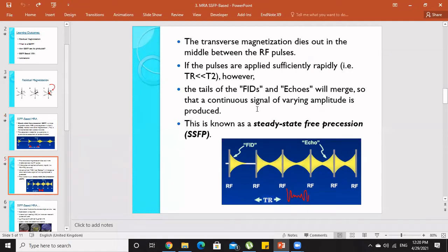Why? If you are giving it equivalent to the T2 or far beyond that, then there will be another phenomenon. If you are achieving the T2 weighted image, it will be for the water only, but it will take some time. But we need it in a single one, and that needs less time. Angiography, we have to do angiography, so the TR should be very much less than that of the T2.